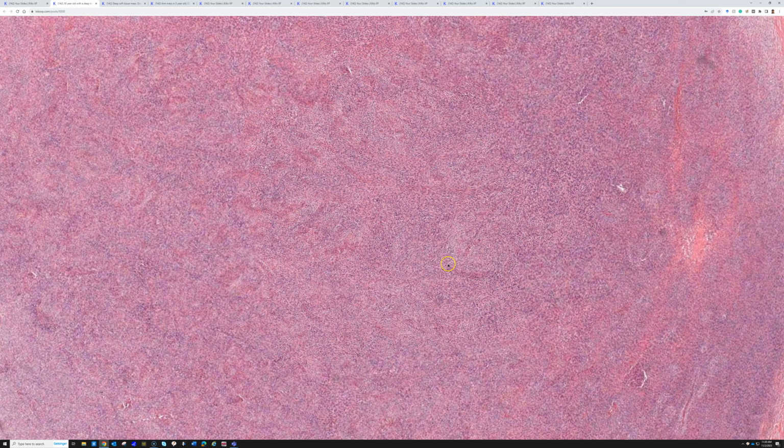So in this case, it's easy to tell because there's so much mature fat. It's easy to tell that this is not a myxoid liposarcoma. But in some cases of lipoblastoma, you can have extensive myxoid change, and those cases can very closely resemble myxoid liposarcoma. So in cases like that, I like to get molecular testing. The reason is that in a young child, liposarcoma is extremely rare.